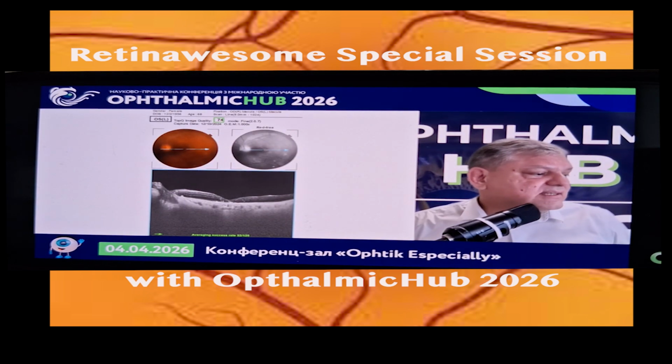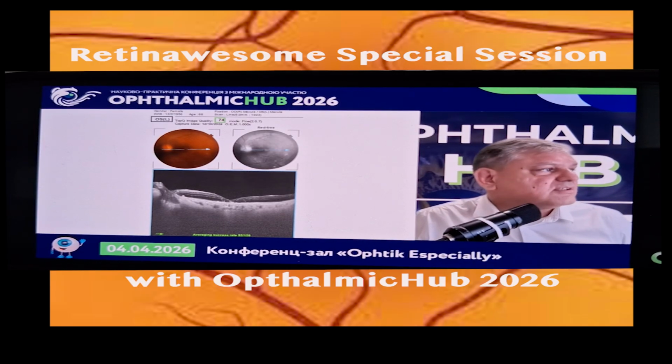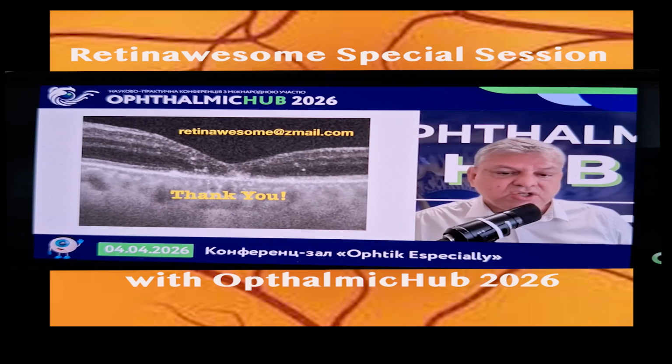This is a very interesting case, and you've got the post-operative period here. The retina, the hole is completely closed. A very good case.